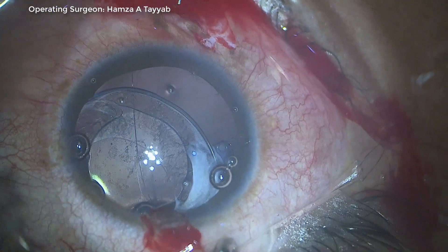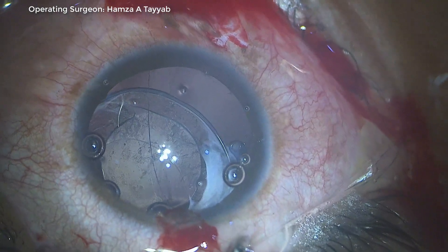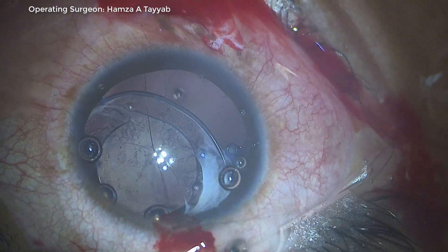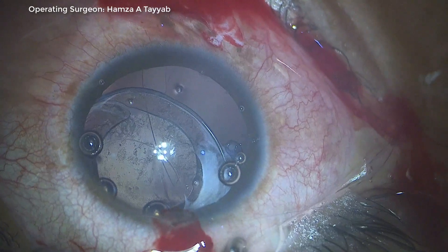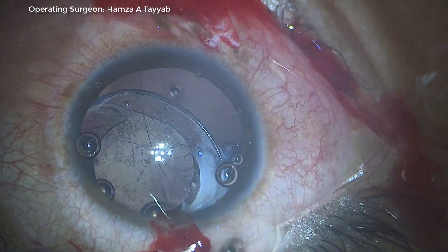I pass one thread behind the CTR, and my plan is to pass another thread of this double-arm 10-0 Prolene suture above the CTR so that it can pull the CTR inferiorly.